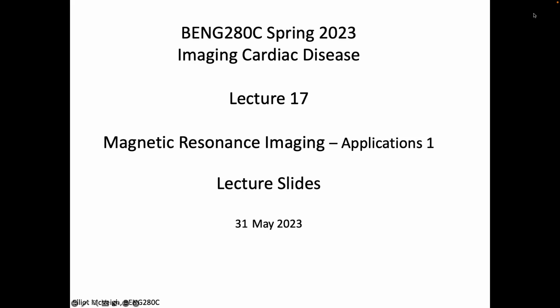You phase lock on the QRS, so you can assume you're at the right point, plus or minus 10 milliseconds. However, the shape of the heart will be slightly different depending on how long the previous R to R interval was. For example, my R to R interval might oscillate between 1,000 milliseconds and 750, which can happen. People get into this bigeminy state where they have a short beat, then a long beat, then a short beat, then a long beat.